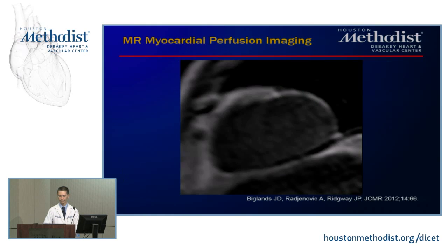Okay. This is just showing it in real time. Let's see if this plays.